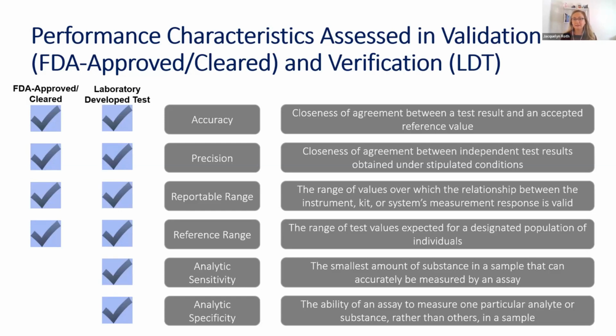Much like the analytic sensitivity, the specificity is also only needed to be done if you are doing a laboratory developed test. So right here, this is a great take-home slide of the bare minimum parameters that you would need to validate or verify.